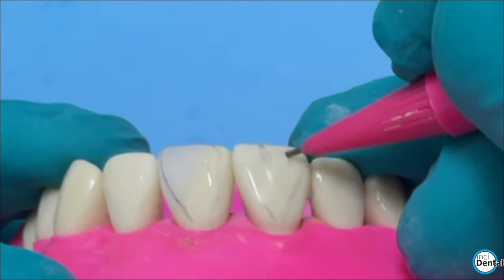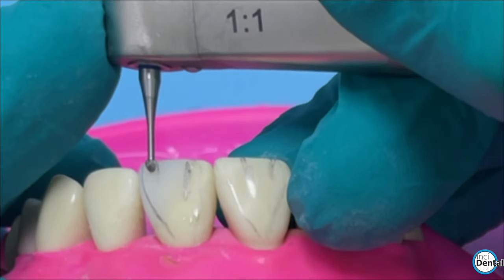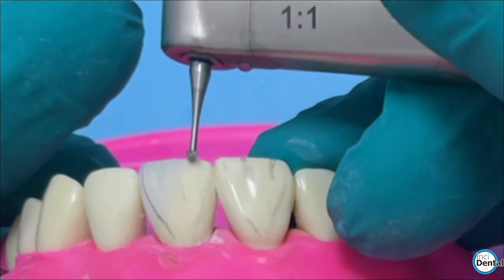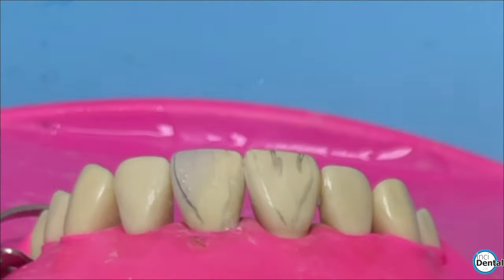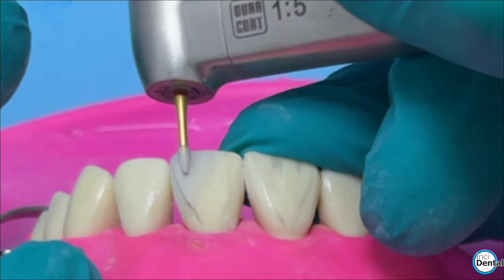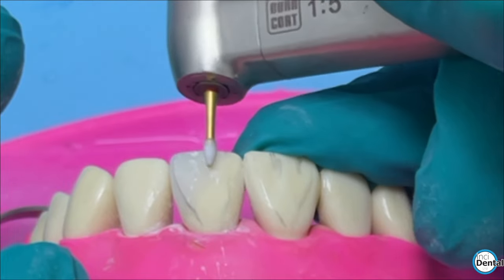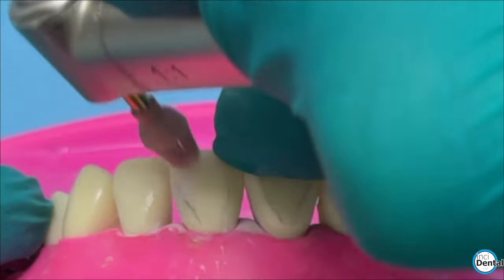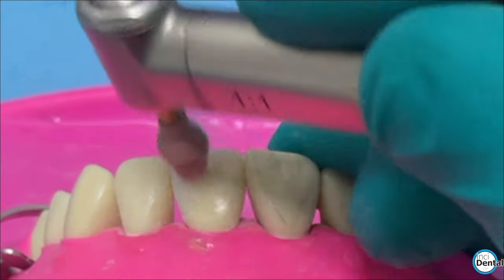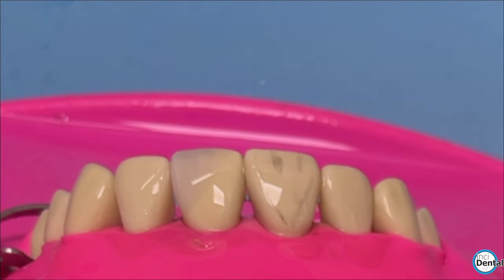Now I've rechecked the line angles — the distal line angle has been pushed out and I'm happy with it. Now I'm going to put in a little of the secondary anatomy — the lobes. I've tried loads of ways over the years and the best method I've found is to use small rose head carbide burrs from the kit. You can sterilize them, they're not single use, and they cut really well. Just gently trace in the secondary anatomy and lobes. Then I use the torpedo bur to feather those grooves in and soften them, and then back to my favourite — the Ocloflex — where you can get an angle into those grooves and soften them off, using the water on with a light pecking motion over the whole tooth, particularly into those grooves.